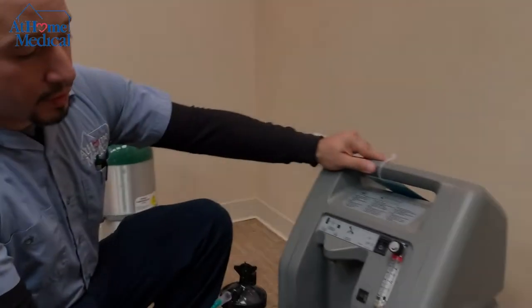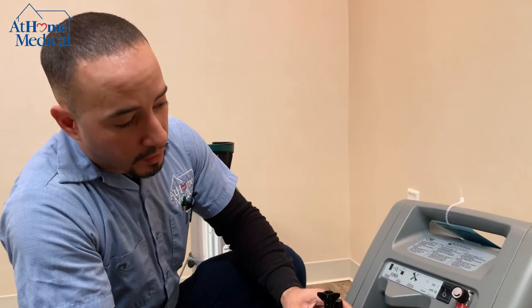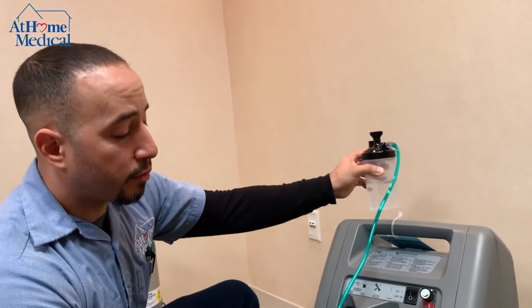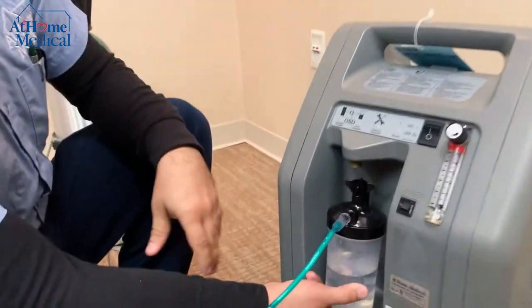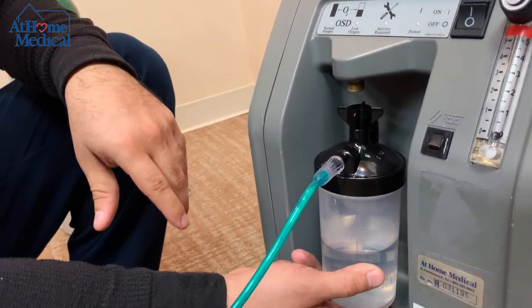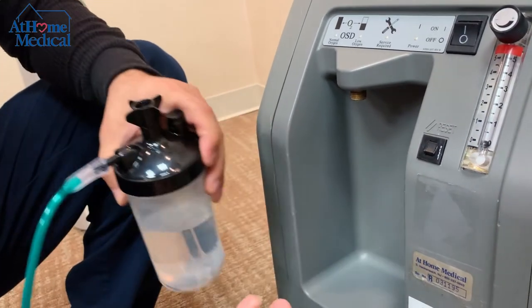Some units are very similar in their own ways. On the other unit I showed earlier, the humidifier bottle rests at the back of the machine, but for this particular unit, the humidifier bottle attaches to the front.